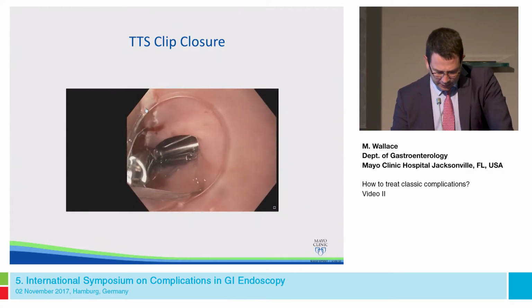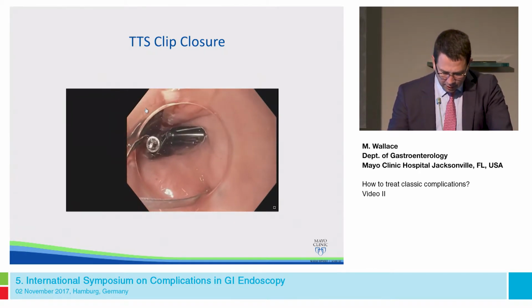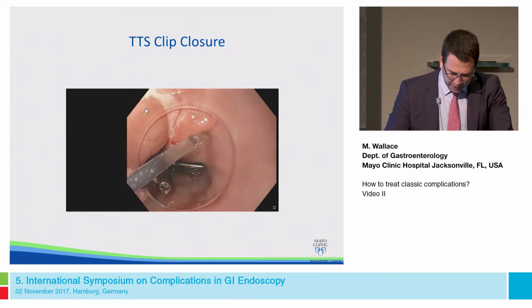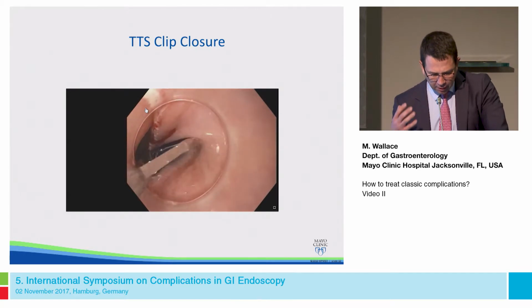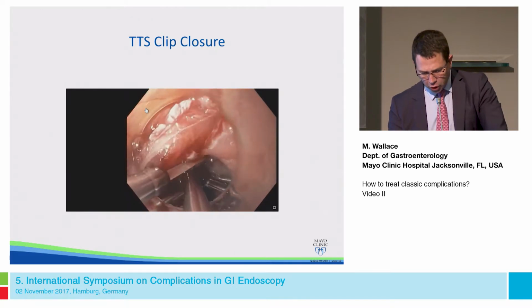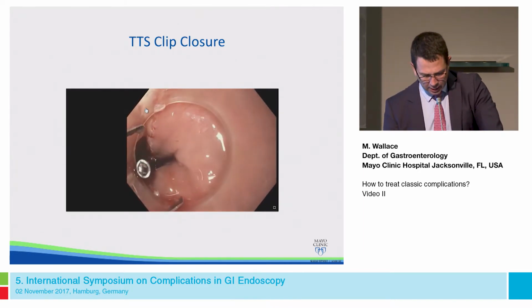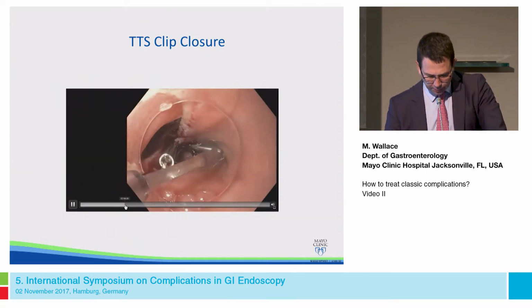With a lot of these longer procedures, I try not to think so much of the very end game as to try to get the next clip placed perfectly. It's quite important to avoid misplacing a clip because one misplaced clip, particularly at the beginning of the procedure, can make it very difficult to place subsequent clips. You really want a linear, sequential passing, and you can see how many clips we placed distal to the actual perforation because we're trying to pinch that closed. So again, I'll skip ahead a little bit here.